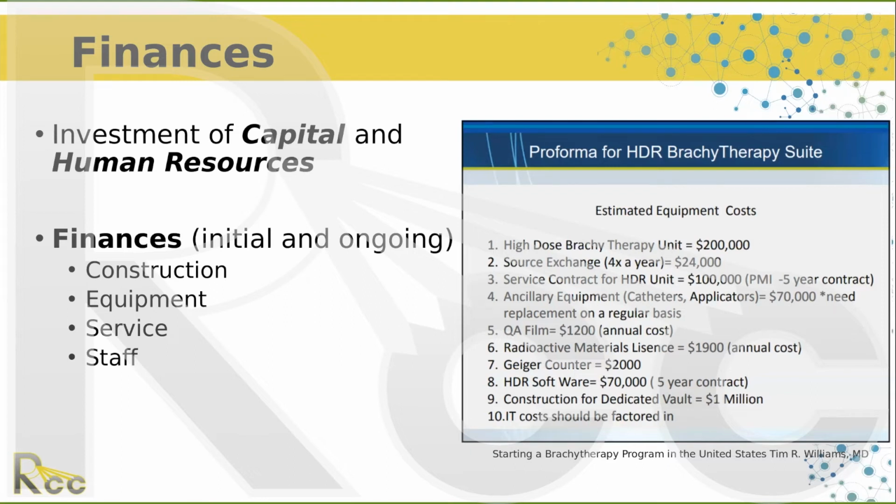I would imagine if you're doing the simulation on a flat table, then you probably want to do the treatment on a flat table too. But if you're borrowing a diagnostic CT next door in the radiology department, it has a curved couch, I'm not exactly sure.